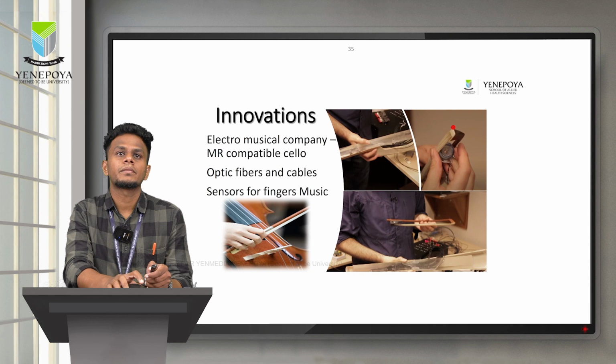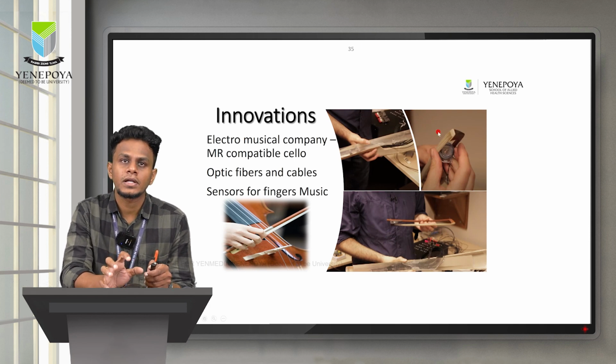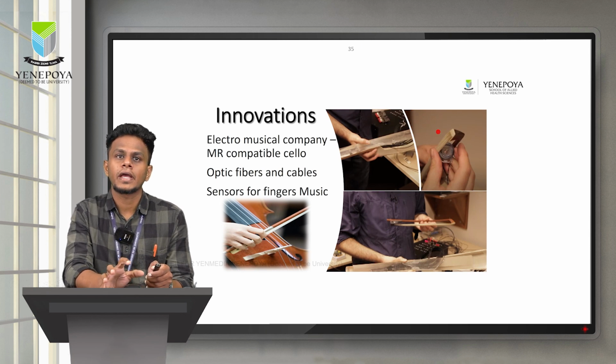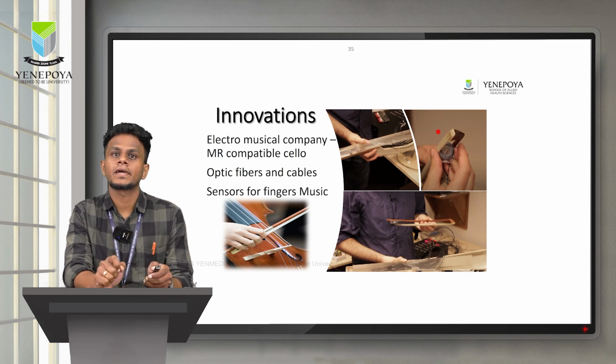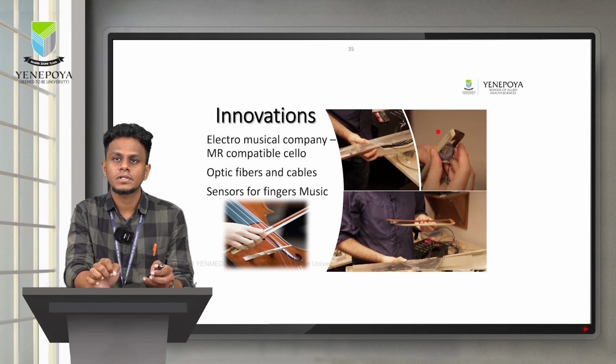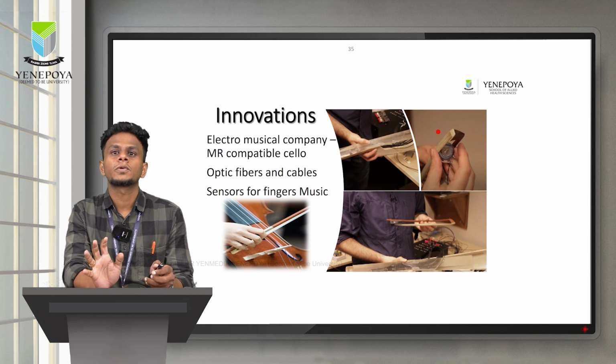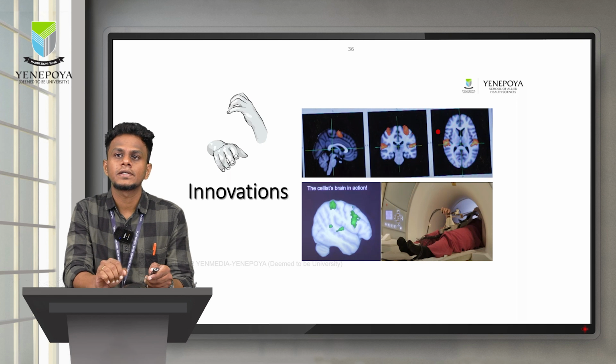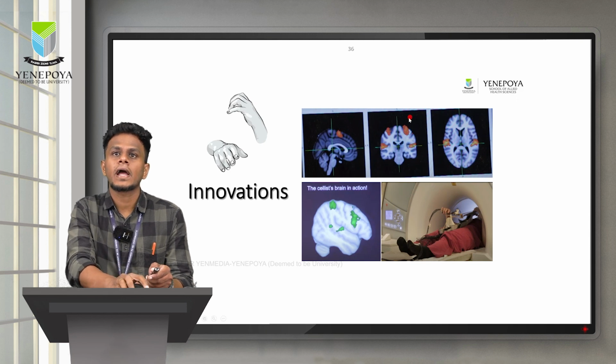There was an electromusical company which helped a lot in making these fiber optic cables and fibers that are compatible, along with the corresponding sensors for the fingers when the patient is changing the chords or strings in the left hand and the corresponding right hand. Each and every sensor is fixed, and then they experimented by doing an MRI while she played the cello inside it. So they found an activity.